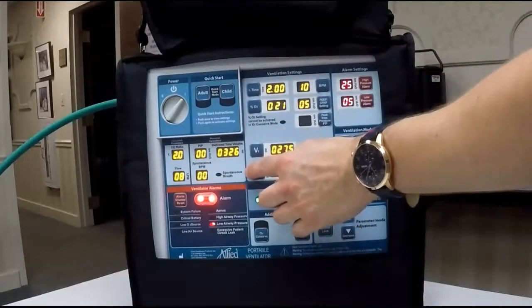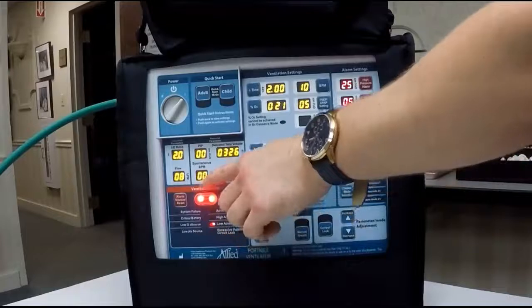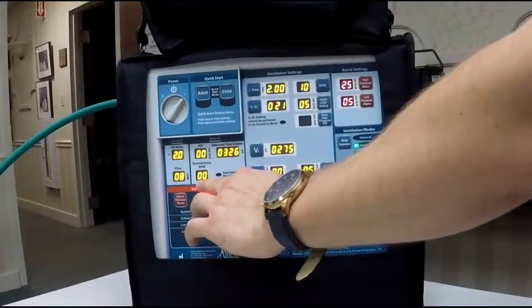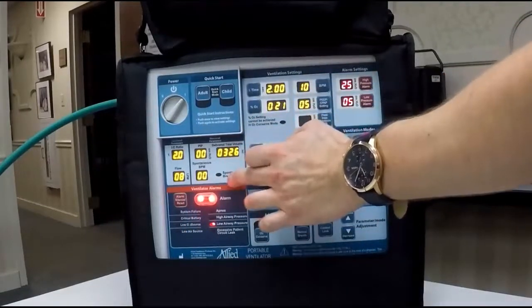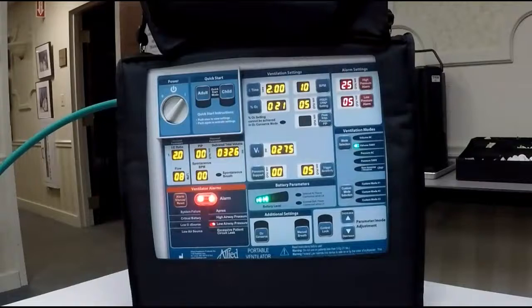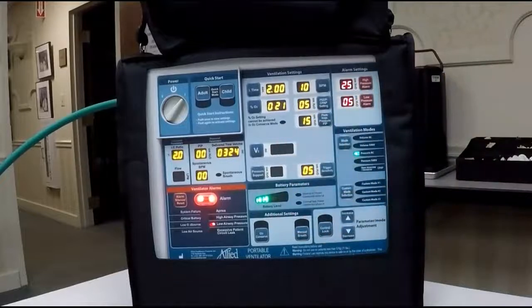Whenever a patient takes his or her own spontaneous breath, during the act of the breath, this will light up, as well as it'll tally every 60 seconds. So this is spontaneous breaths per minute. So it'll start over every 60 seconds. And these two here, parameters or readouts, are good to monitor, so then you know whatever mode you are in, you can also see how many spontaneous breaths the patient is taking over how many mechanical breaths you have it set. And lastly, you have a flow readout. That'll only be available when you're in a volume mode. It's not available when you go into a pressure mode because the flow varies so greatly.